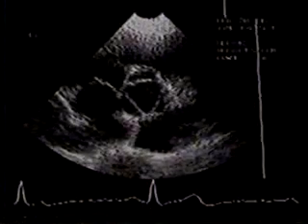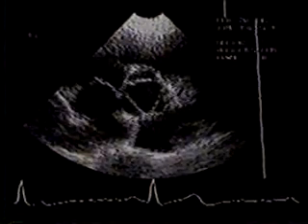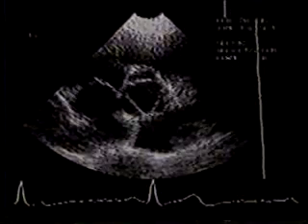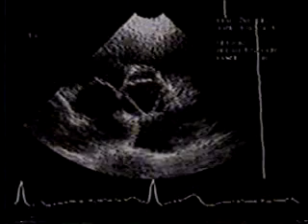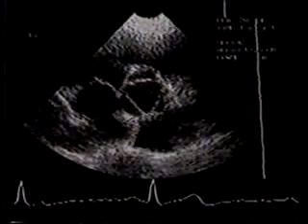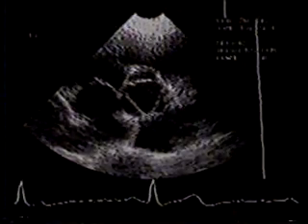We have now completed the short axis examination of the heart from the left parasternal position. Review the short axis anatomy as the heart is scanned in real time from the aortic valve level to the level of the papillary muscles.